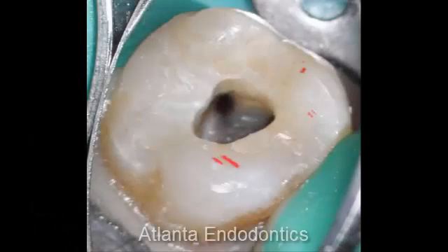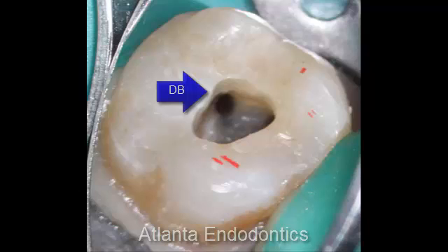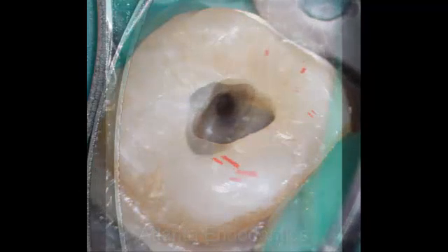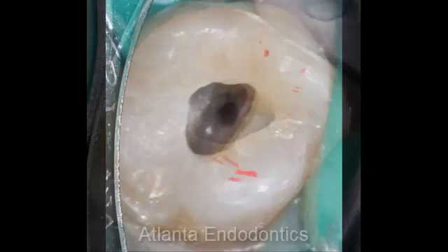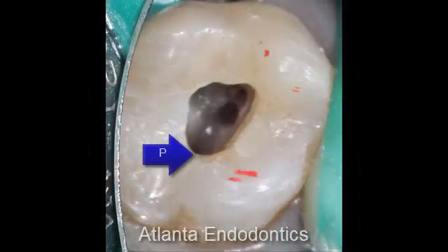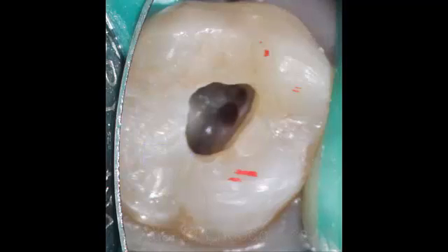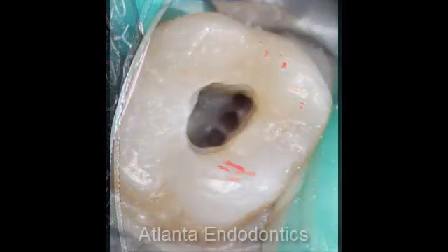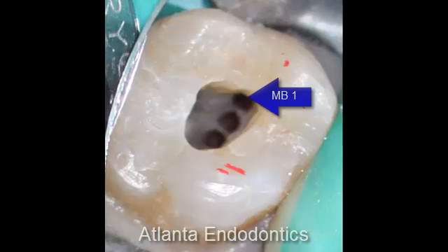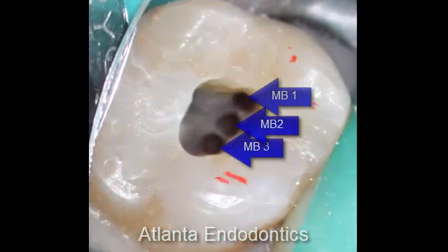During treatment we open up the tooth and we find the canals. Having the camera handy is nice because if we have any unusual anatomy we can document it immediately. This is cleaned out — we've seen the distobuccal and the palatal canals, and now we can see the MB1, the MB2, and the MB3.